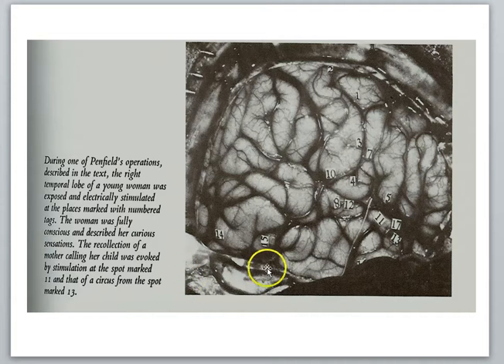Now, how does it measure the functional aspect of brains? To understand that, we have to know a little bit about brains and their blood supply. What you're looking at here is an exposed portion of the cerebral cortex. This is the right side. The skull has been removed, and the whitish-grayish areas here are the surface of the brain. Now, these big tubes here are the blood vessels, right? So the brain is very metabolically active. It uses a lot of glucose and a lot of oxygen to support the electrical activity that it's constantly generating.